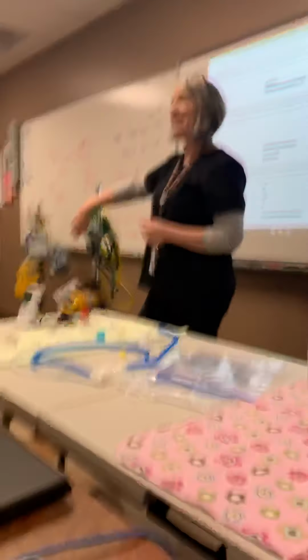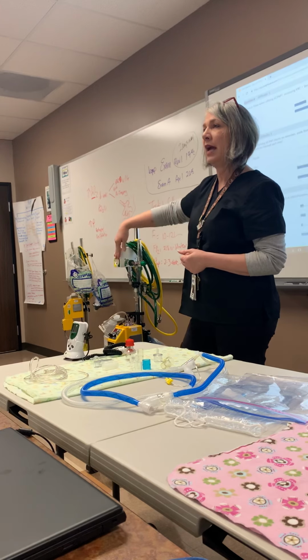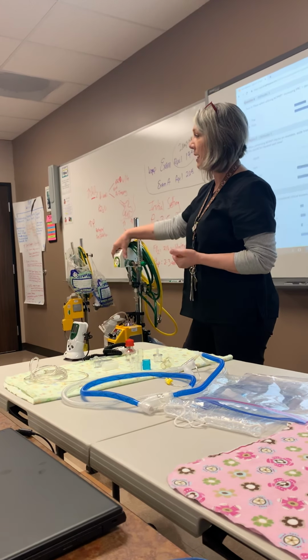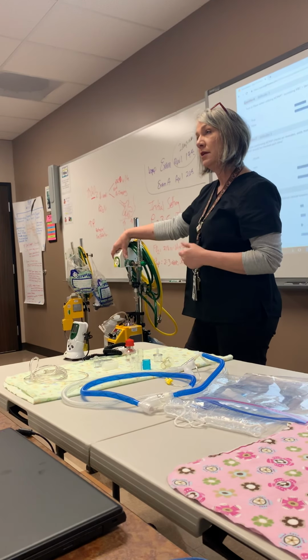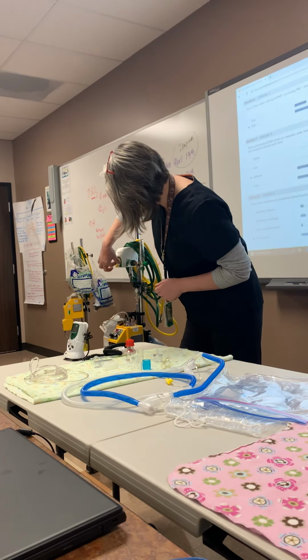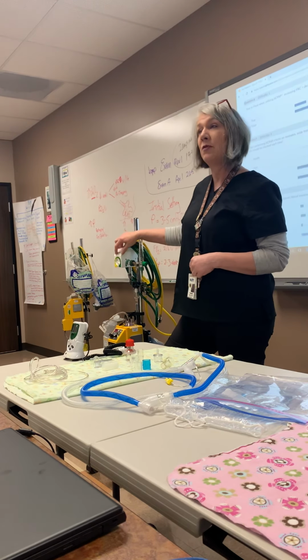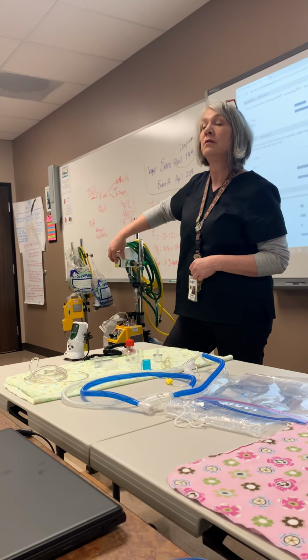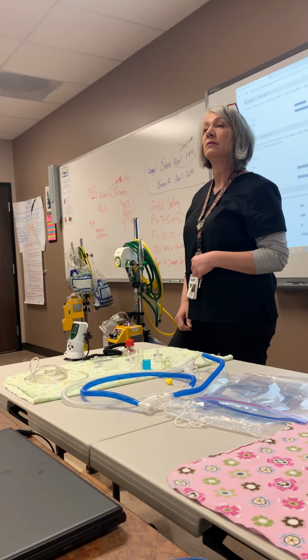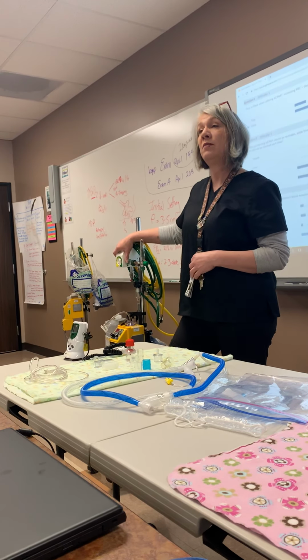Air, right? Your blender, blending oxygen and medical air. This is where we set our FiO2. So for our question on the quiz, we would have set it all the way up here to about 52-ish, okay? If we were just starting, down to 21%. Make sense? Blender.